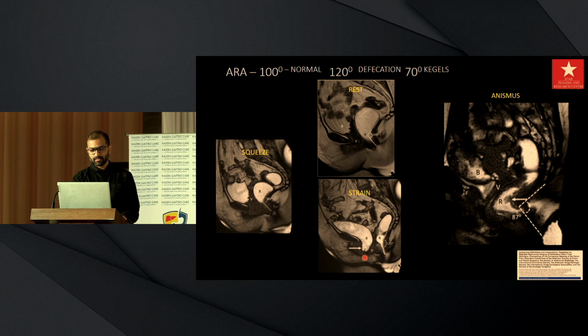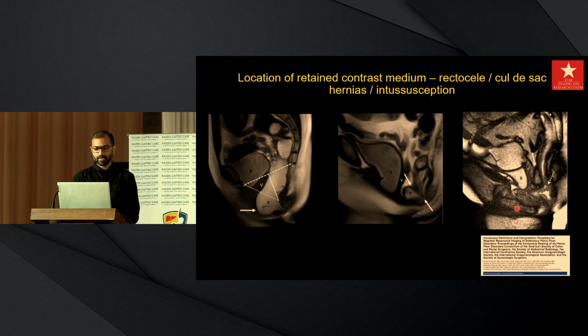We also see there is a cystocele with the bladder neck going down. But what happens paradoxically in dyssynergic defecation is that there is this tug on the indentation on the posterior wall of the rectum created by the puborectalis, and then instead of an expected increase in the angle, there is a paradoxical reduction in the angle, and hence the patient is not able to evacuate the rectum.